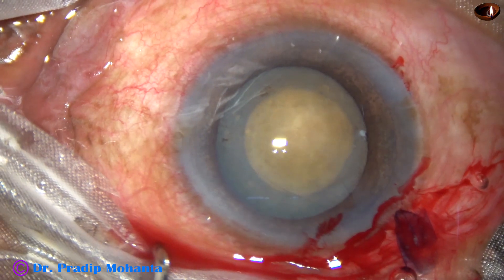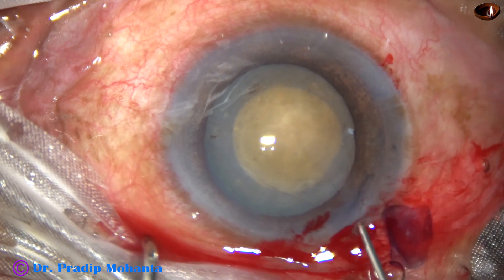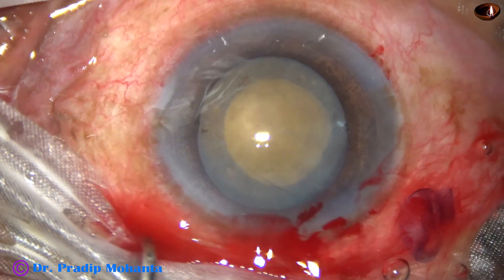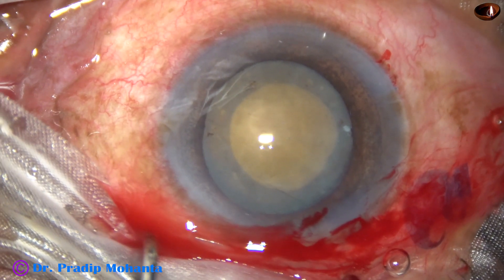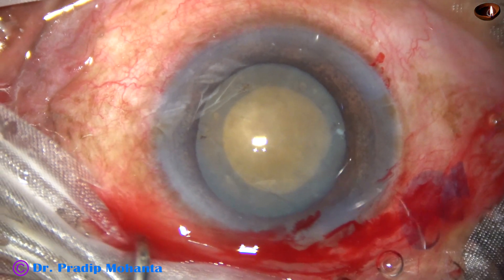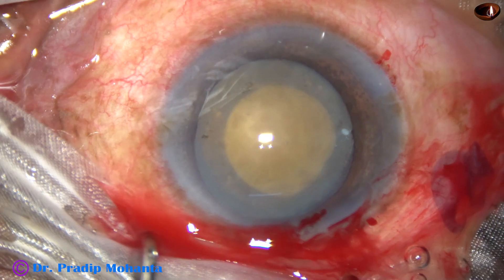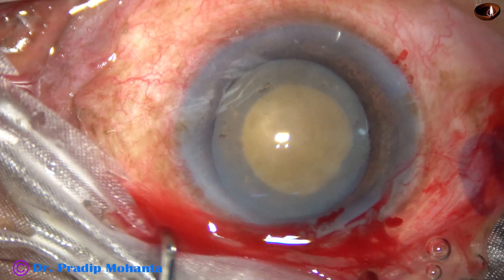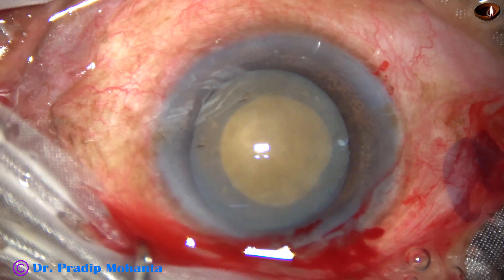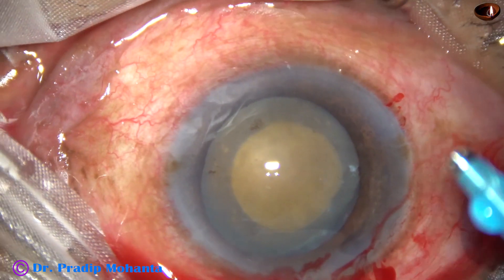With this size of rhexis, if CTR is required, it will be easy to apply. Some more visco is injected into the anterior chamber, and then the tip of the phaco handpiece is being introduced into the anterior chamber.